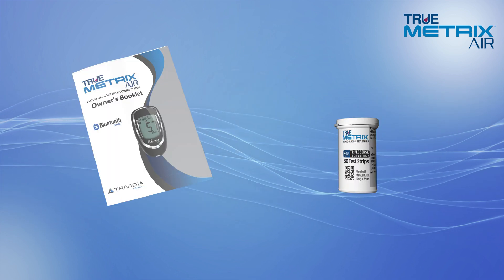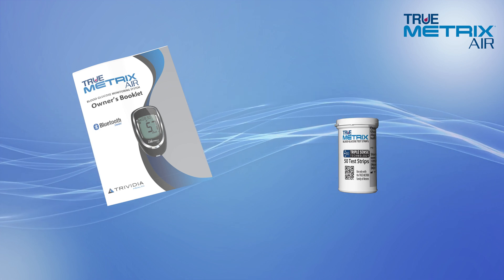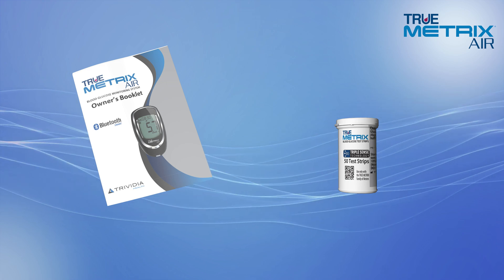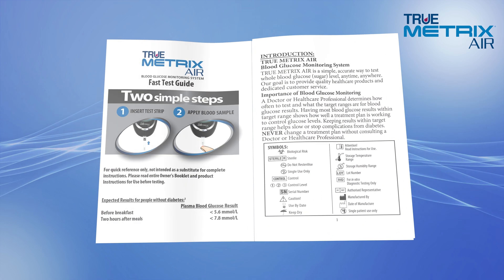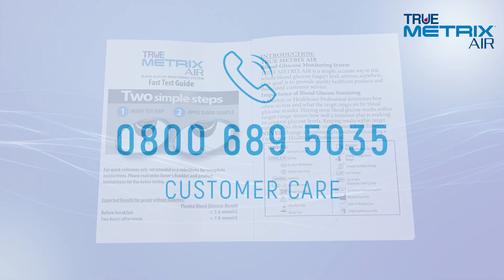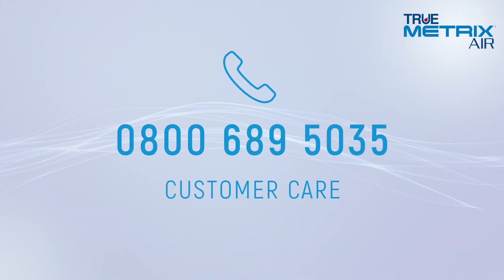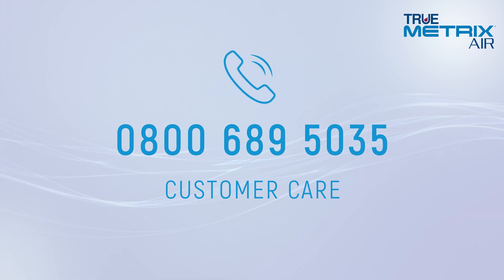This presentation is designed to help you test with confidence and familiarise you with the TruMetrix Air Meter and TruMetrix Test Strips and demonstrate how to perform a blood glucose test. If you choose to use the other helpful features of the system or want a more comprehensive review, please see the owner's booklet or call our customer care department at 0800-689-5035 and they will personally assist you with questions you may have about the TruMetrix Air System or help you perform a blood glucose test over the phone.